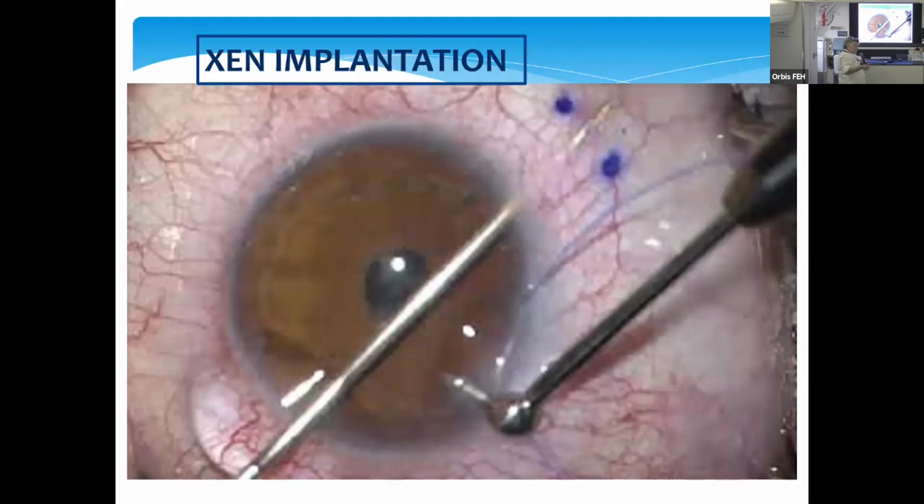You've got something you can roll on the injector, and you start pushing it. And so you see the needle come out and you impale your TM. And then you direct it so that it comes up. The needle pops up and you think you're going to poke through the conj, but you don't. You want to see it right under the conj. You want to pop through Tenon's, and there's a potential space there. There's a space waiting for this. And then you inject it so that you're going to have an intrascleral portion, a portion under the conj, and a portion inside the eye.